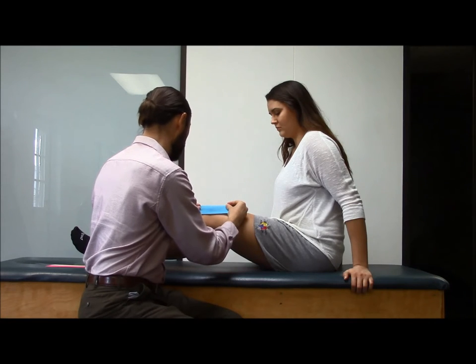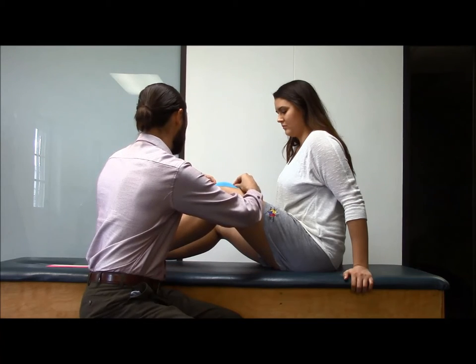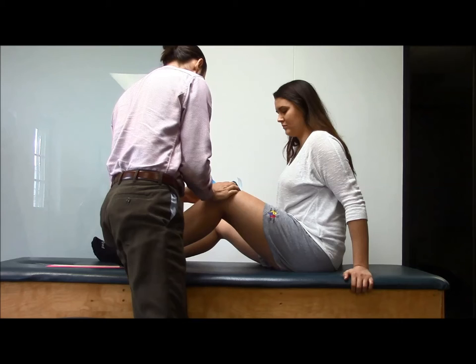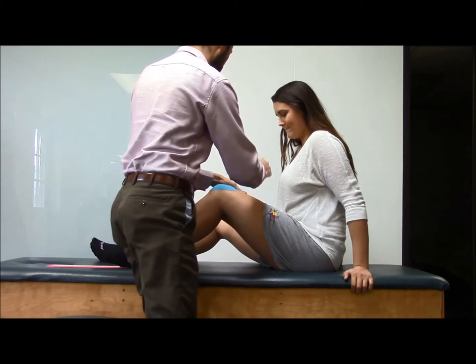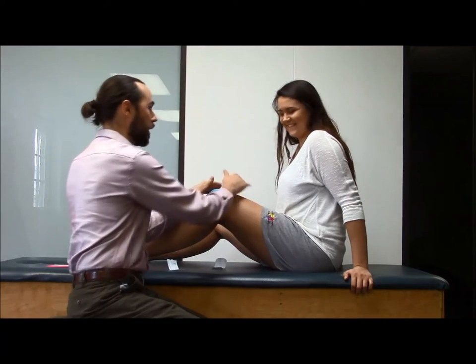As she bends her knee a little more — go ahead and bend a little more — I'm going to wrap that around with a good amount of tension, just like that. And then just a little tension on the ends here. Not my best horseshoe ever, but it works.